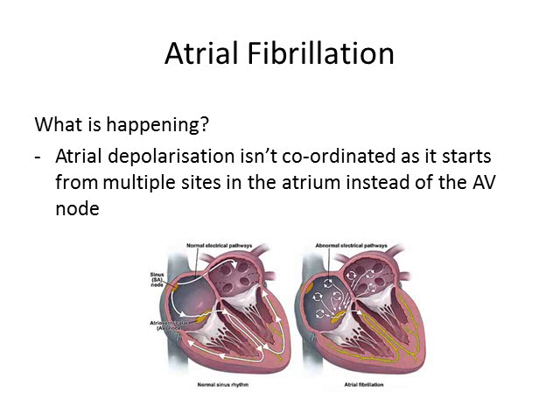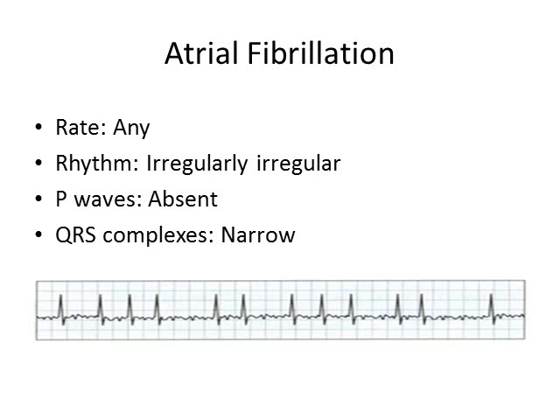And the reason you get an irregular pulse, which is kind of the hallmark of AF, is that these impulses won't all cause a QRS. So what I mean to say is that some of these are going off all the time, and dependent on what the AV node's doing and what part of the cycle it's at, some of the impulses will be brought through to the ventricles and others won't. So it's kind of at random, and you can see that on the trace. You get this random irregular pulse, no rhyme or reason to it.